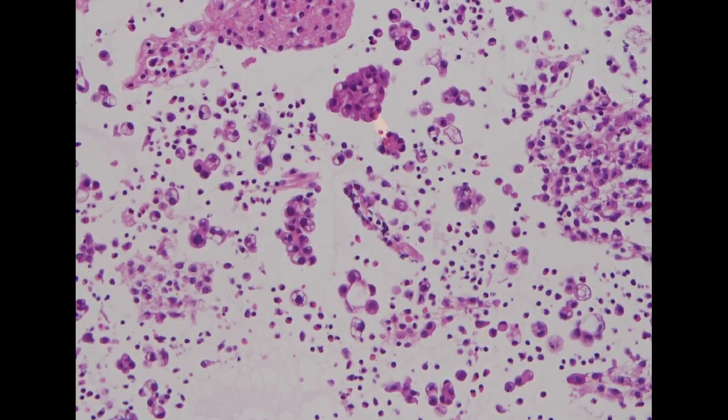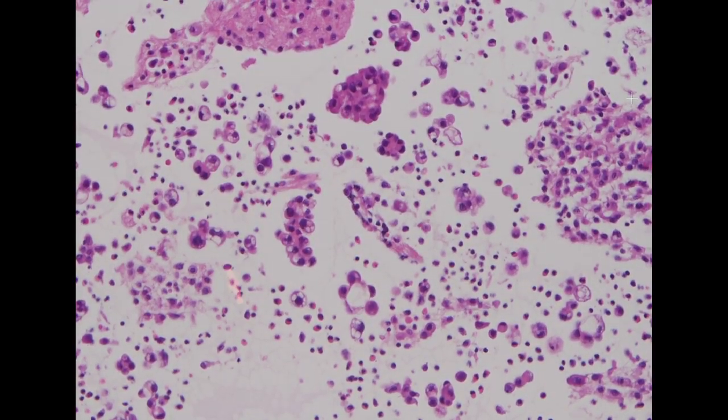If you take a look at the cell block preparation, you also see a lot of adenocarcinoma. So we will do a TTF1 to confirm that it is coming from the lung primary.